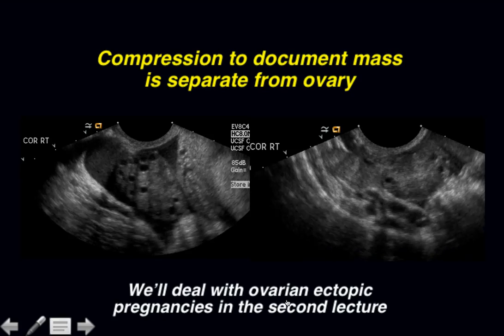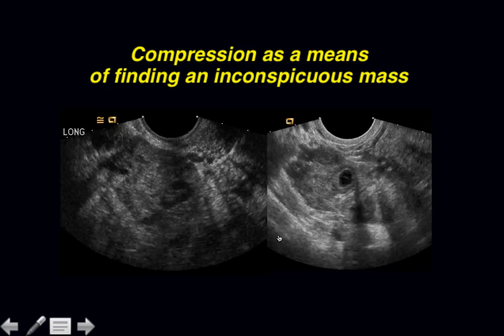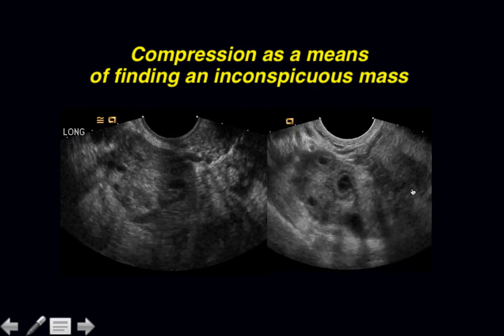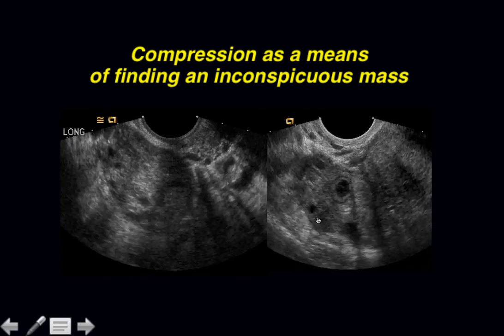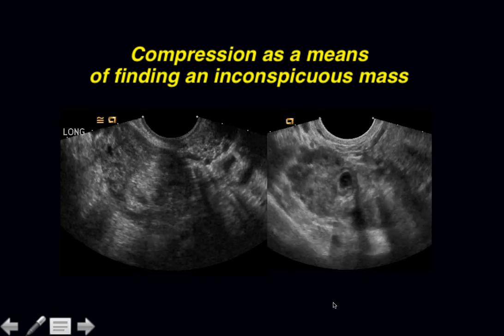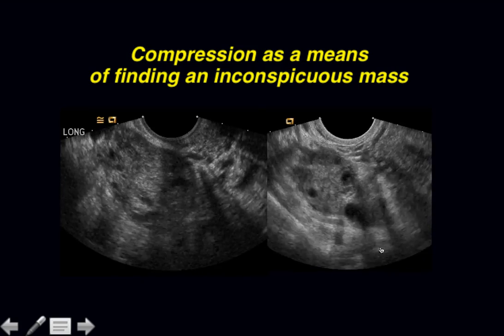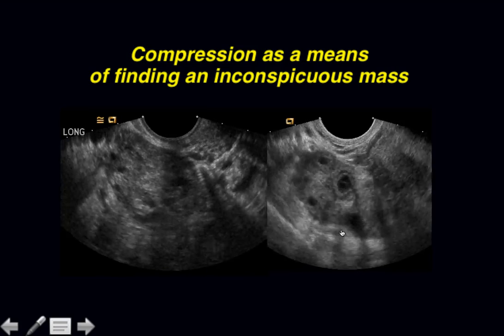As I said, we will deal with the ovarian ectopic pregnancy in the second lecture. So here we see a mass that appears to be within the ovary as it moves with the ovary. Here we see a mass that moves separate from the ovary. And of some considerable interest, I would like you to see that compression actually is helping us to see the mass. When compression is relaxed, you will notice that the mass is reasonably inconspicuous. The mass becomes increasingly conspicuous as pressure is applied.